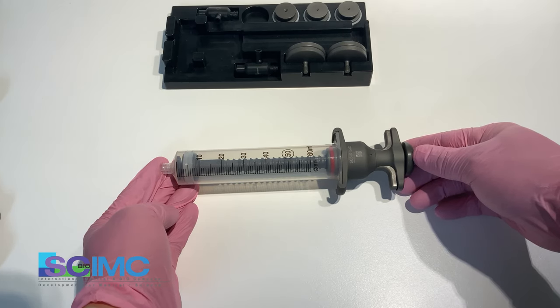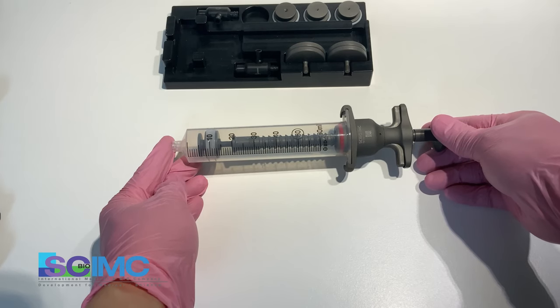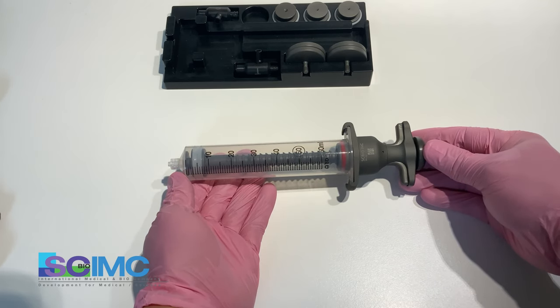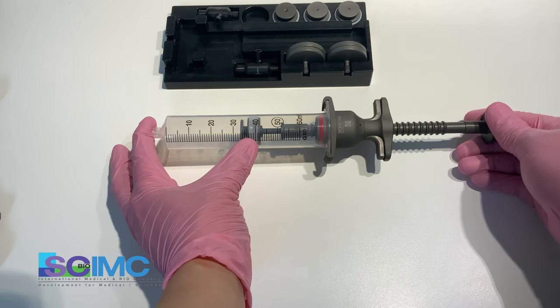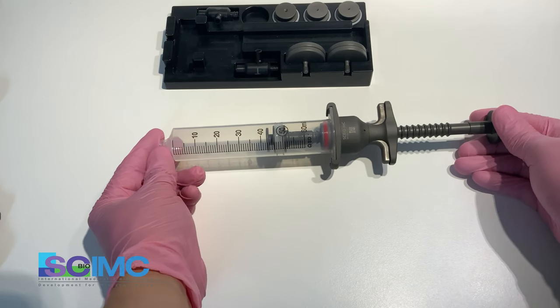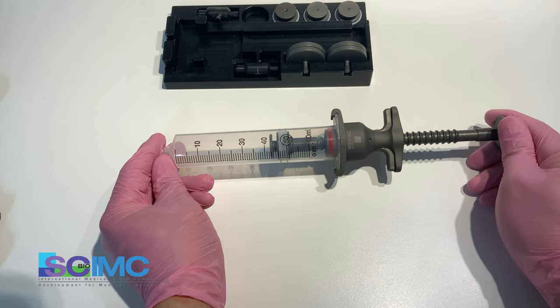If you want lower negative pressure of about 500 mmHg, pull the plunger about 10 cc. If you need more negative pressure of about 700 mmHg, pull the plunger and position the piston over 30 cc. The negative pressure power is then about 750 mmHg.